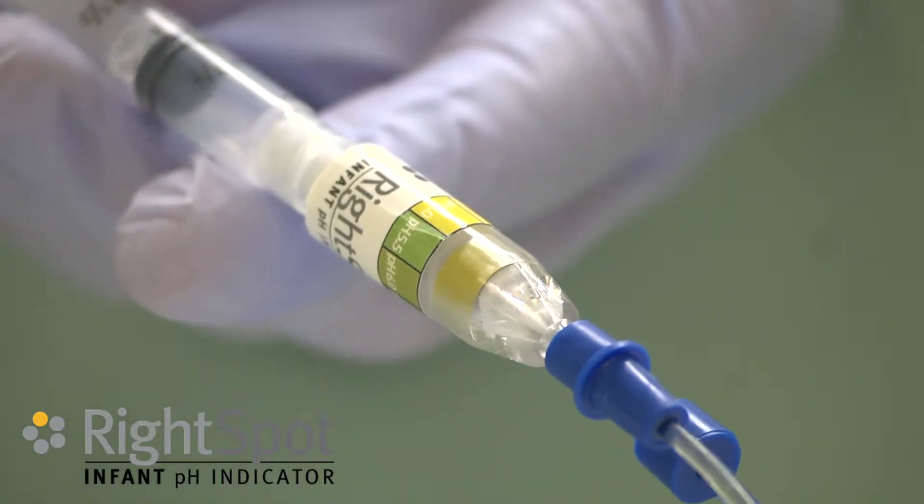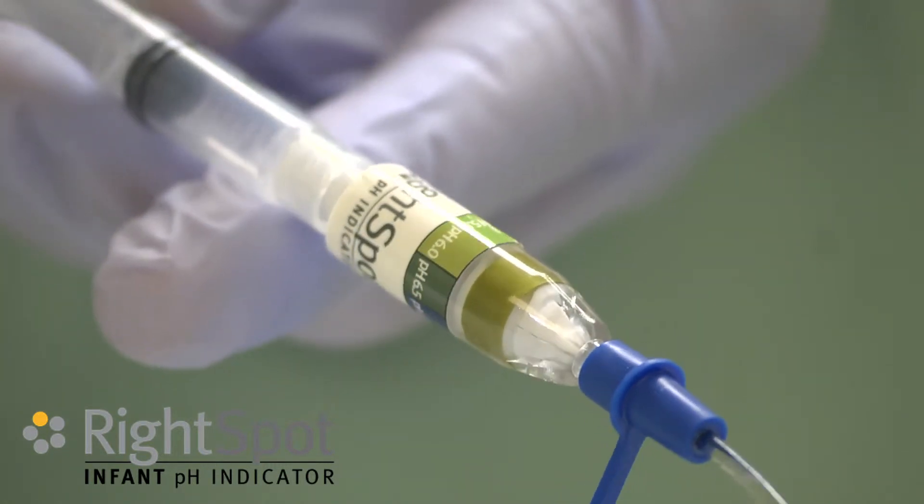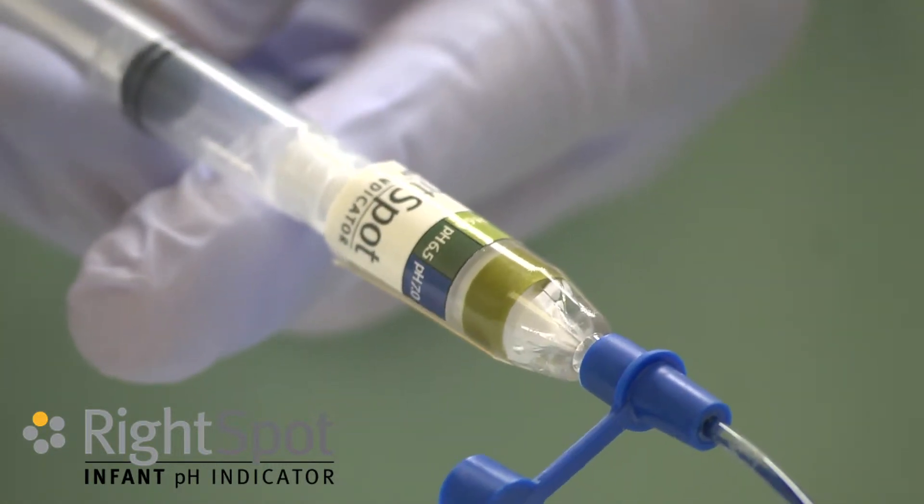Aspirate stomach contents until the indicator changes color. The color can be compared to the reference colors on the device.